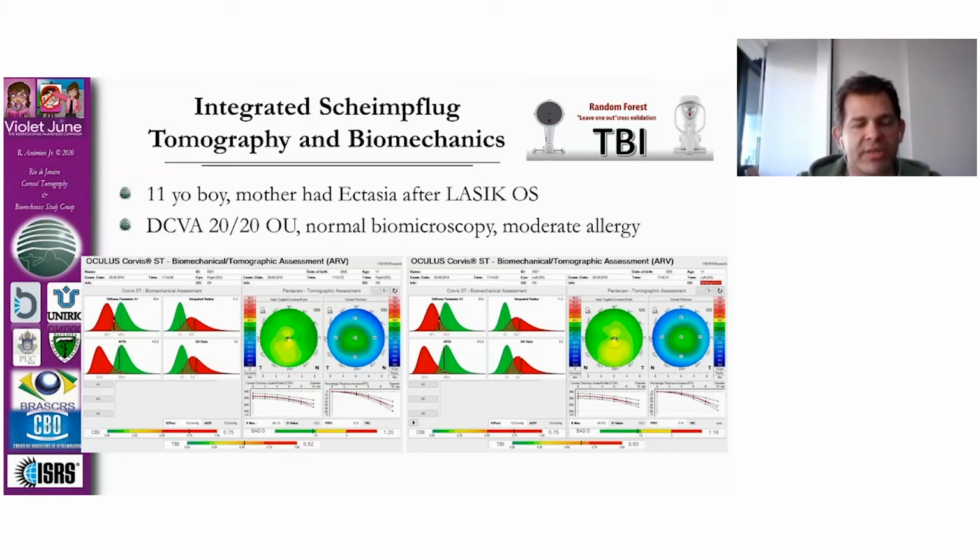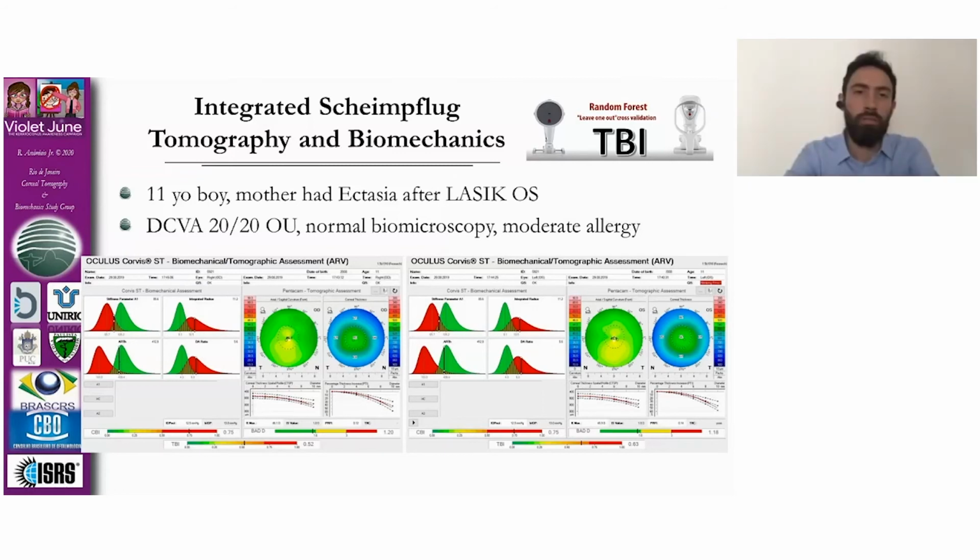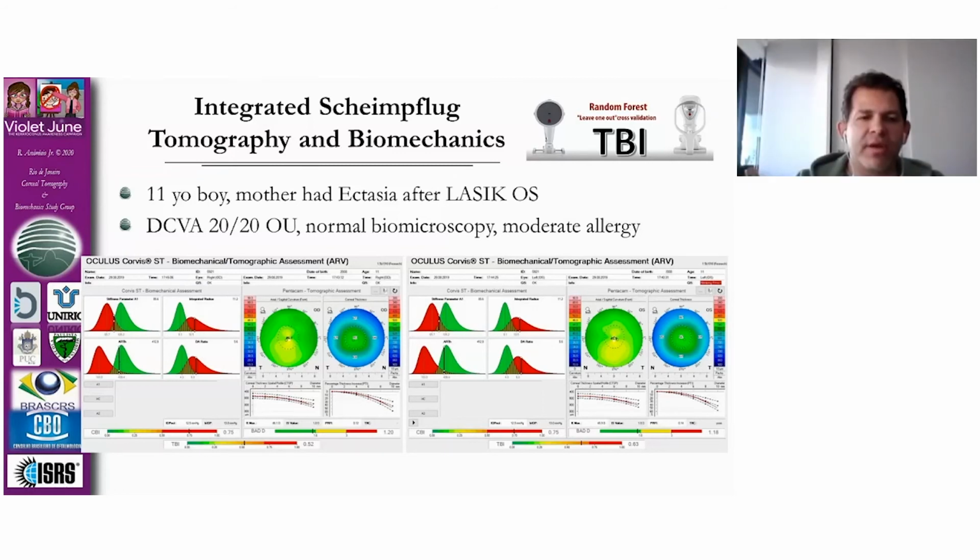We have to understand patient age. We look at other factors, why the patient wants refractive surgery. Absolutely, contact lens is a very big issue because of contact lens warpage. I come with a new term of micro warpage: if the patient used the contact lens for a couple of days, it can change the TBI. So, how many days after contact lens discontinuation should we wait? All of these factors should be considered, and every case should be individual.